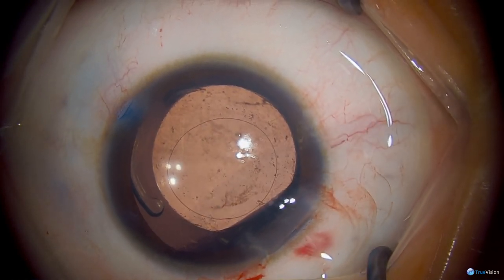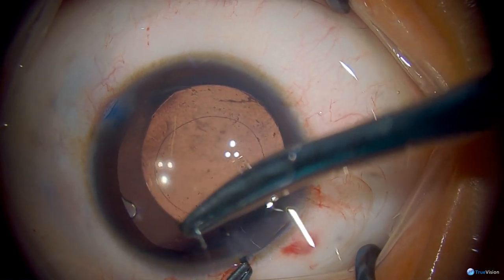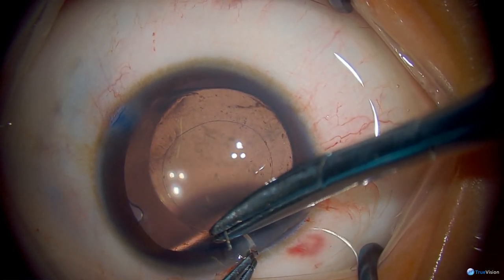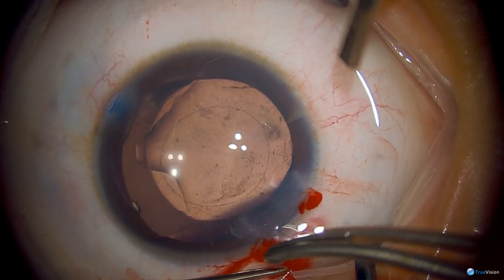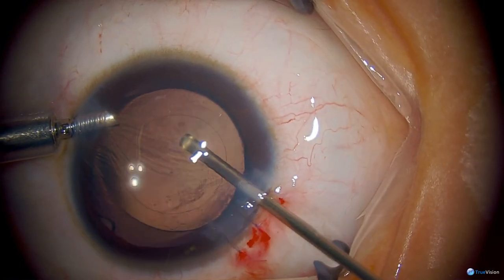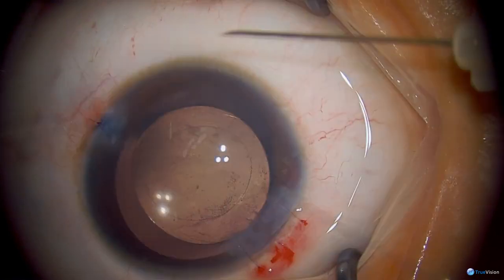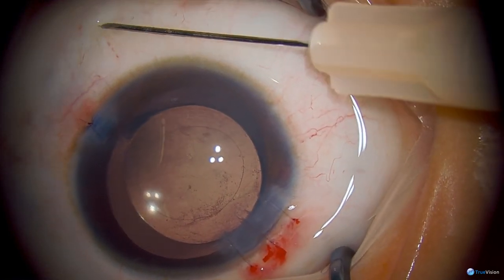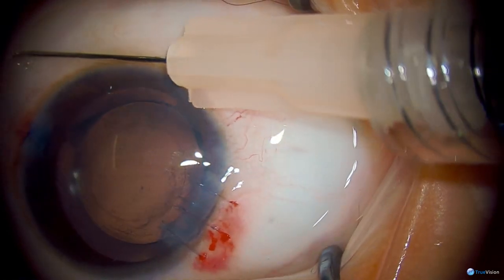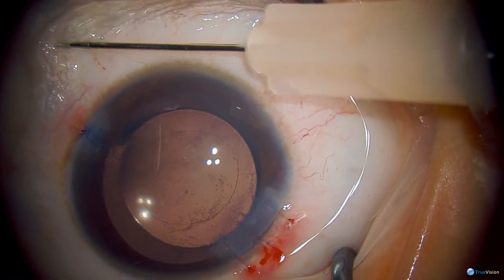This particular Alcon lens is really ideal for these circumstances, and at least in the US, this is the lens of choice for pediatric cataract surgery. Once that's in place, we've put a suture across the corneal incision to tighten it up again. Now using the vitrector to remove the viscoelastic from the anterior chamber, and then placing some subconjunctival antibiotics and steroids. This step is optional, but may be preferable if there's any chance that follow-up could be poor with your patient.